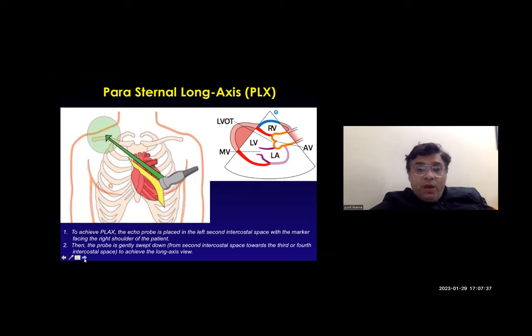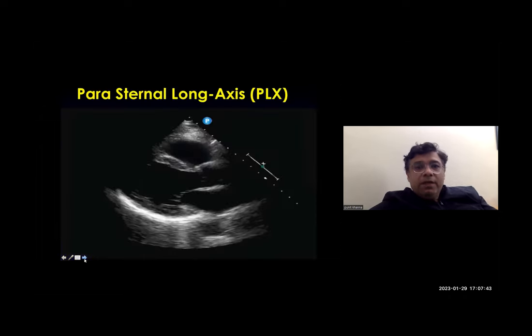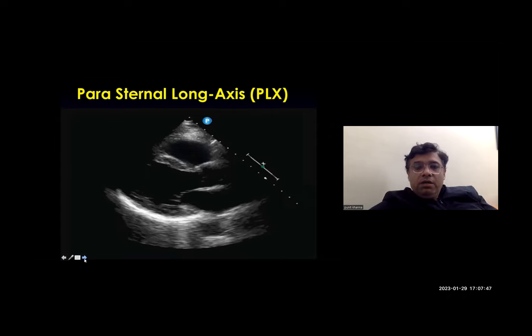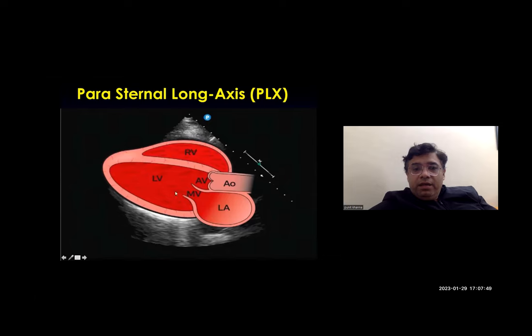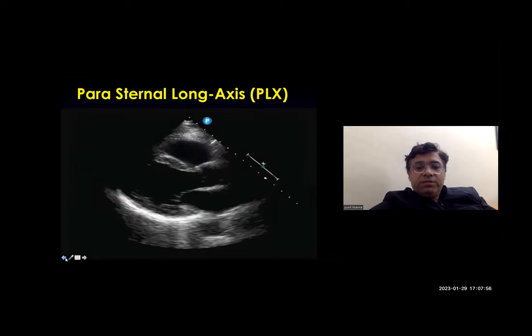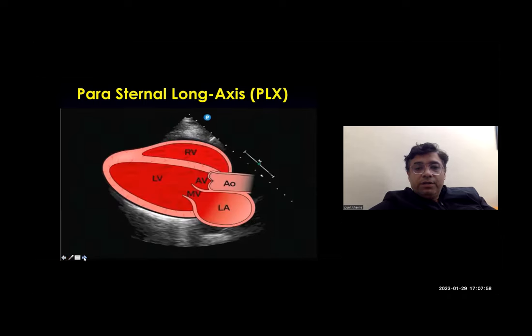The parasternal long axis view shows the right ventricle, left ventricle, aorta, left atrium, aortic valve, and mitral valve. Concentrate carefully on where we have placed the probe and what structures we are seeing: right ventricle, left ventricle, aortic valve, mitral valve, left atrium, and aorta.